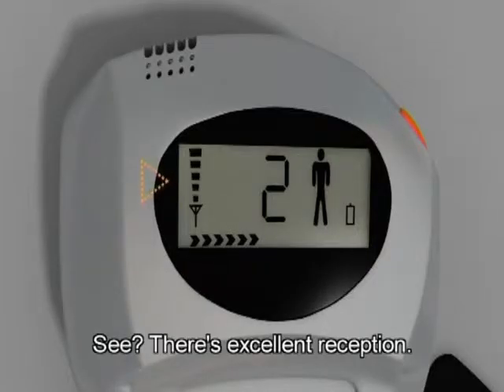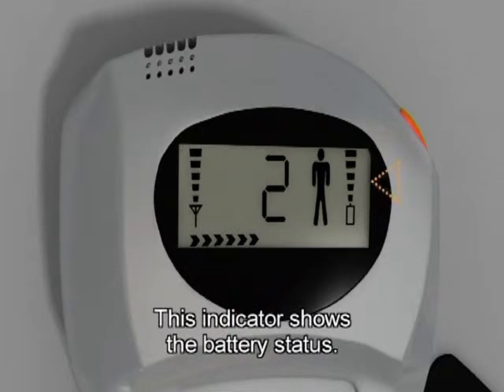See? There's excellent reception. This indicator shows the battery status.